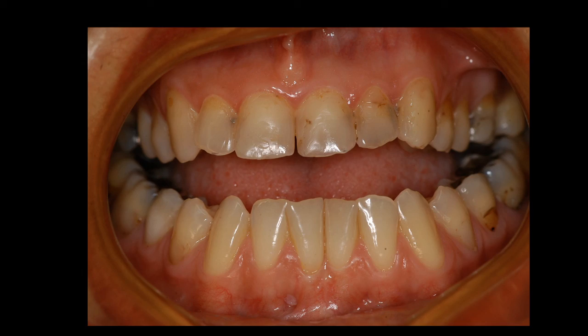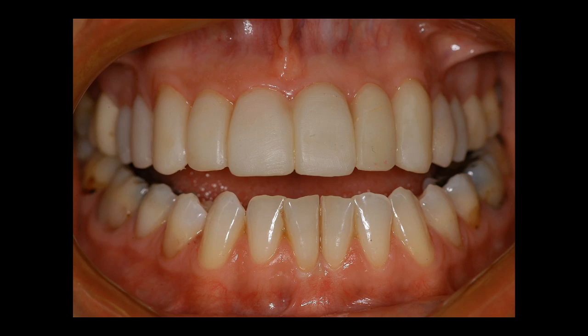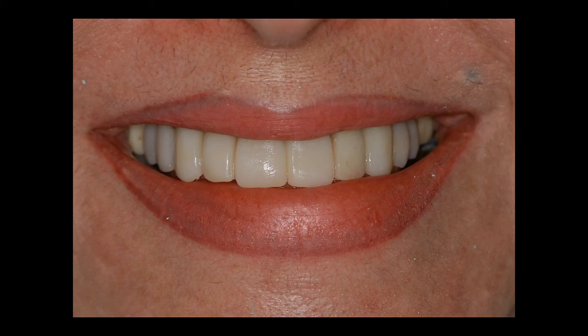with a long face, with an open bite. This is not a situation where we have a lot of stress on the ceramic. But as you can see, hygiene was to be re-evaluated and re-approached. Once the patient was properly cooperative with the hygiene, and she had refused to do any surgical and orthodontic treatment like a Le Fort 1 or double jaw surgery, we tried a setup with the composites, and this patient was very happy with what she got. This was just an idea to give her what we can do with the composite.